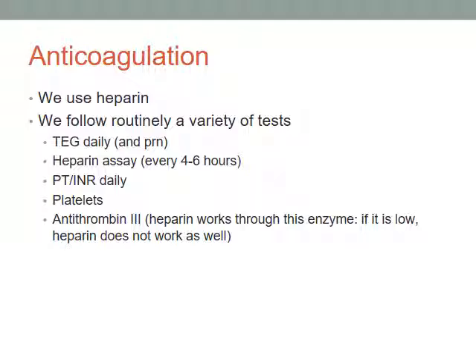Meanwhile, we have other patients who, under some circumstances, we've run without heparin and have done okay. So there is no straightforward answer as to how to manage heparin or anticoagulation in these patients. It's really going to be variable. And then I have this out of order.